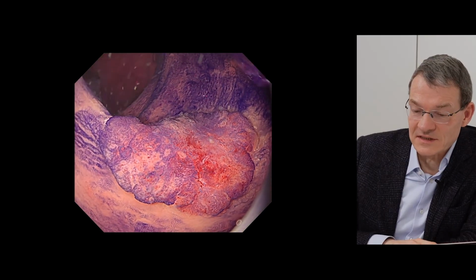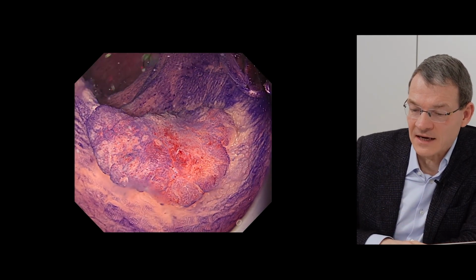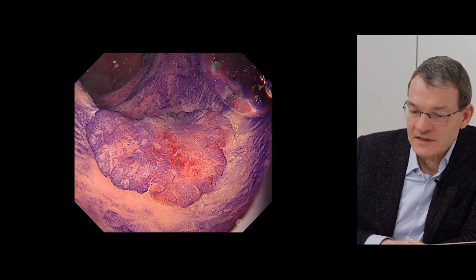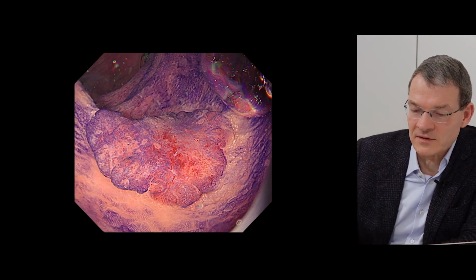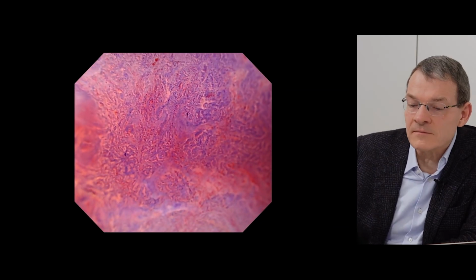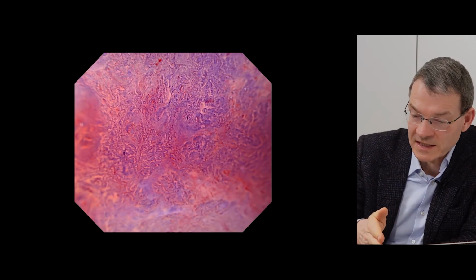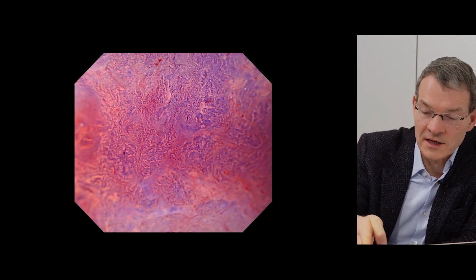So in this case, we used crystal violet. I will show you the images again later. So we put this underwater, and in this polyp, we also have two areas. One is the central area here, and what you nicely appreciate, we can see nicely the opening of the pits.